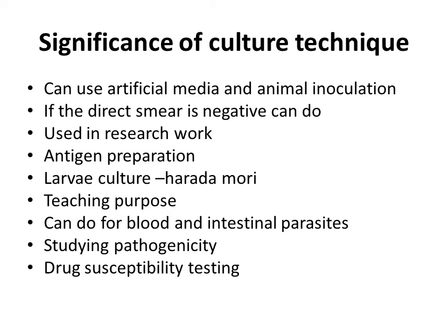So we have to go for the concentration technique, because by concentrating the specimen that contains a low amount, we are concentrating the stages. Even if the concentration technique is also negative, that means such a low number of parasitical stages is present in the specimen, so we can go for the culture.